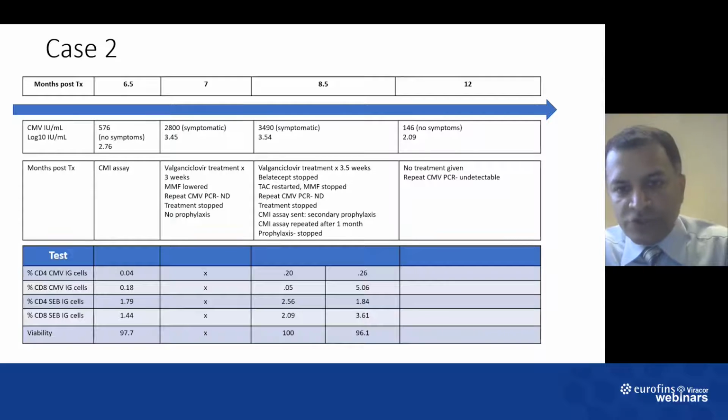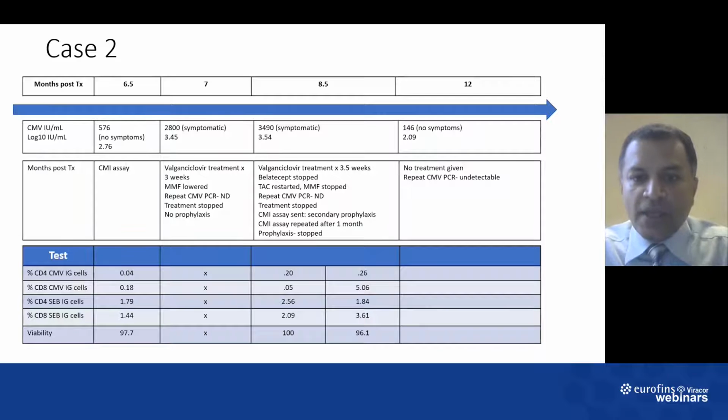and delayed CMV infection. So here we have, again, a very objective test, which along with a lot of other evidence helped us make a treatment decision to optimally treat the patient and avoid all the morbidity and mortality that might be associated with CMV infection or CMV disease. At this point, I'm going to stop, and we'll stop for some discussion later. Thank you.